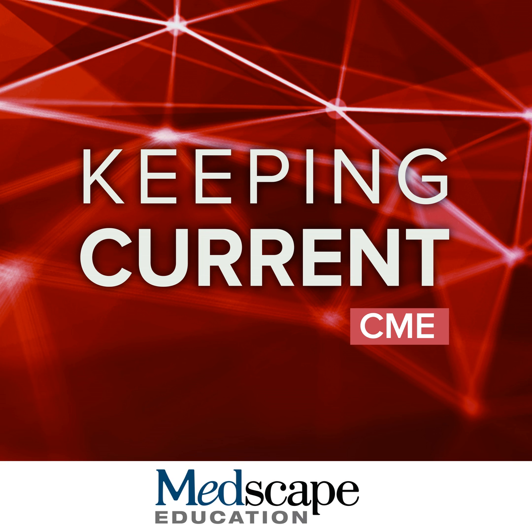How do you think cardiac MR is easier now compared to even 5 years ago? I totally agree. I think cardiac MR is easier now than it was even 5 years ago, and certainly 10 years ago, for a number of reasons. I think we've really moved away as a field from the very comprehensive one-stop shop protocols where we maybe did everything just in case we needed it. So including phase contrast imaging, all the tissue characterization, to very efficient and tailored protocols. Certainly that's the case in our center, but as highlighted earlier, the SCMR has this efficient protocol. And so really we're answering the question for an individual patient.